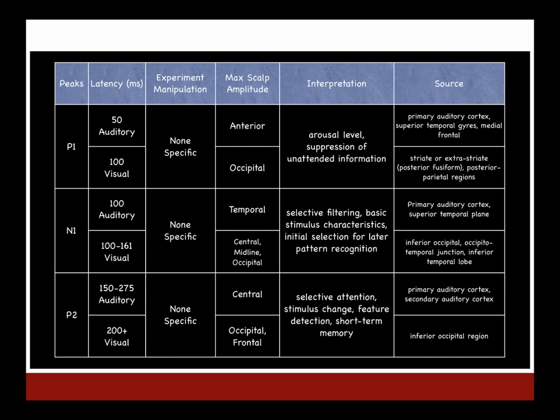And we have interpretations of all of these peaks. Again, the P1, N1, and sometimes even the P2 are all thought to be sort of driven by the stimulus.